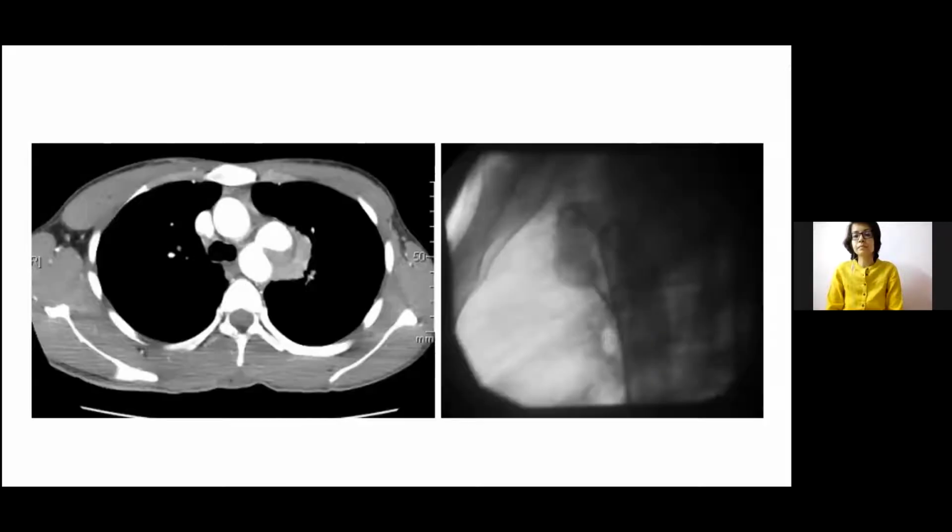So this is the CT scan. We showed this is the neck of the aneurysm. As you can see, some thrombus was sitting inside the whole aneurysmal sac, and the aneurysm had eroded into the lung parenchyma, which was the cause of the hemoptysis. And probably this was growing for some time, and it came into view only when the patient started having hemoptysis. This is the angiographic equivalent of the same shot, showing the aneurysm here.